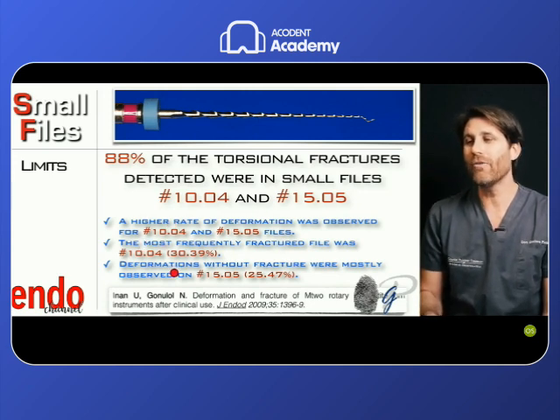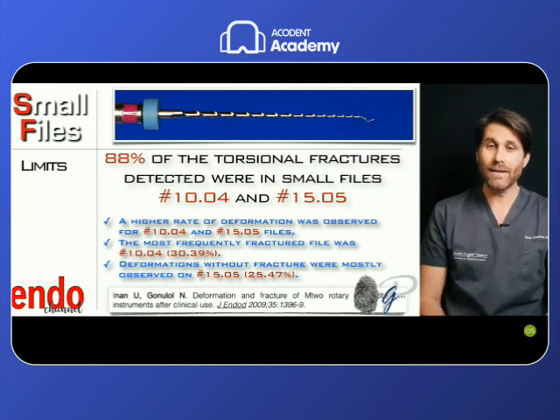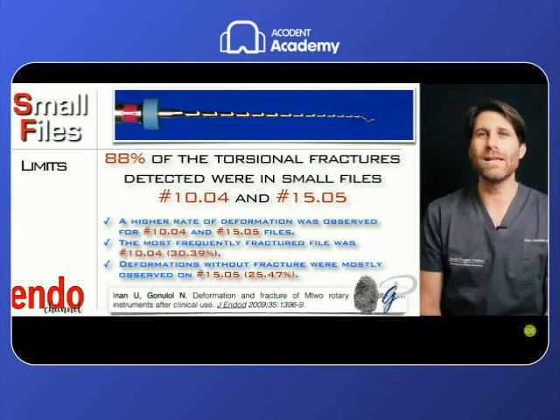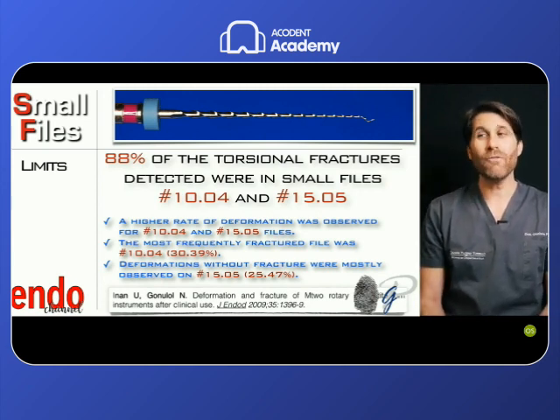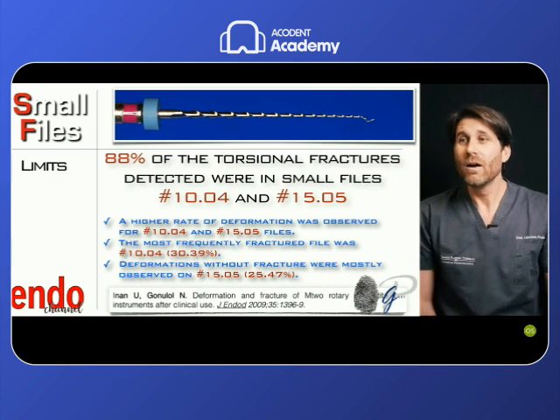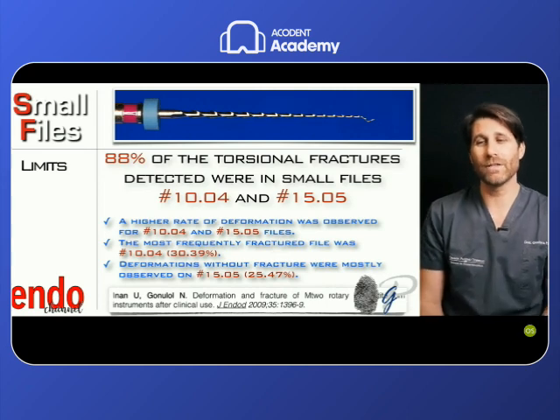What does it mean? It means that smaller files are more delicate and tend to deform and fracture more easily. So we need to improve this limit to have the ideal file for scouting of the apical third.